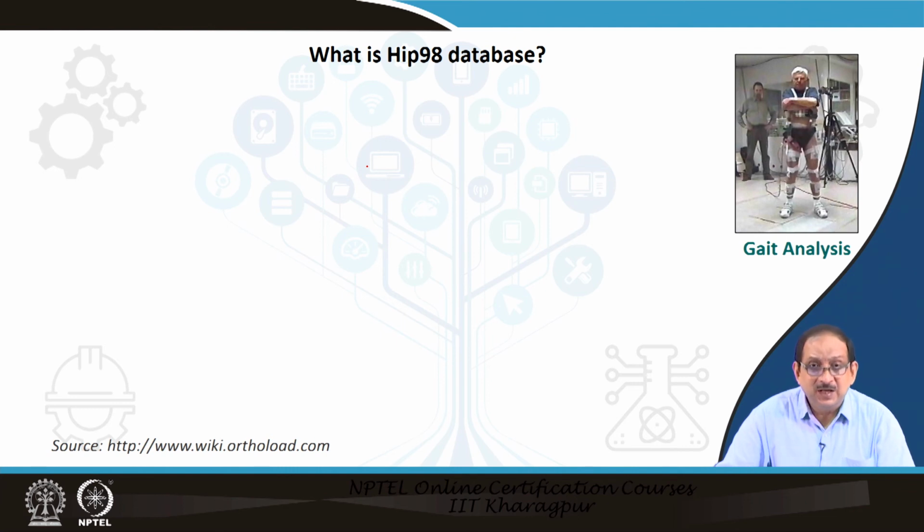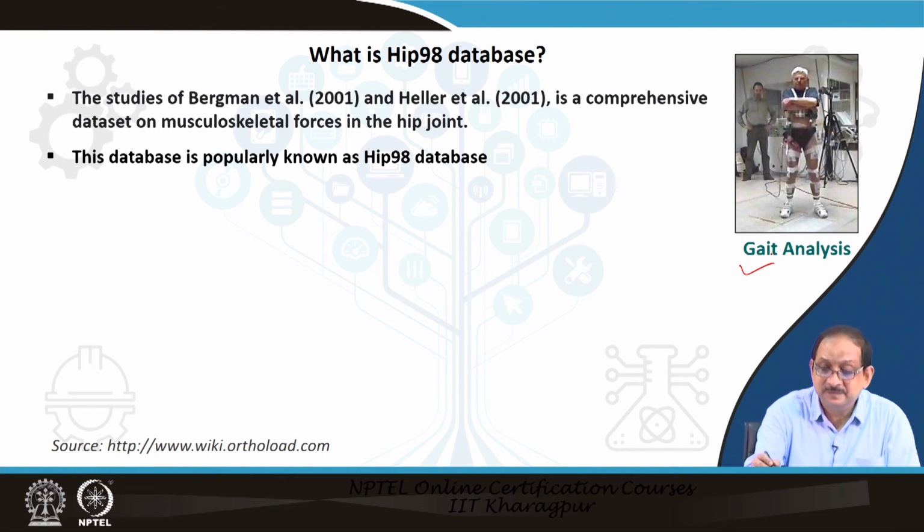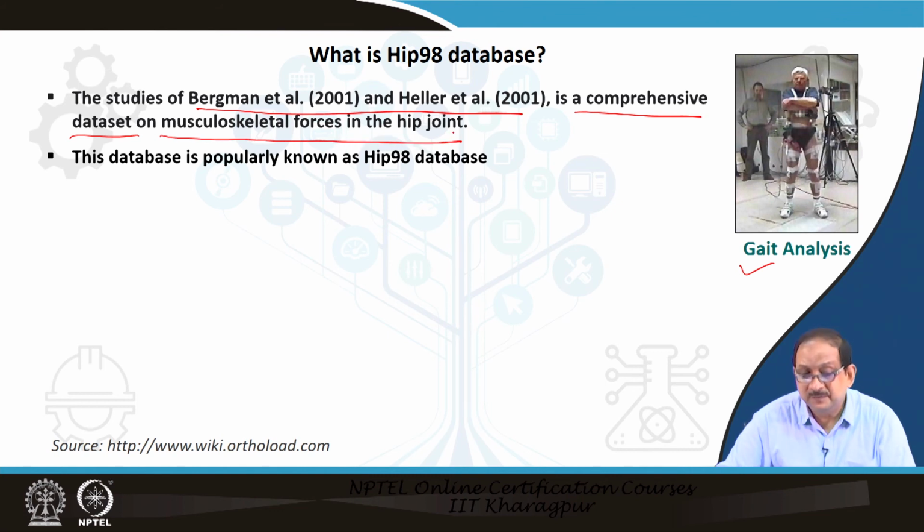Now, what is the HIP98 database? Let me introduce at this point the HIP98 database, which is based on a gait analysis and 3D motion capture system. The studies of Bergman and Heller form a comprehensive data set on musculoskeletal forces in the hip joint.